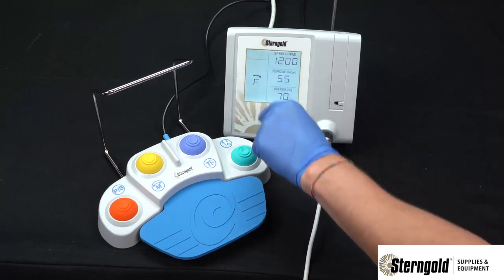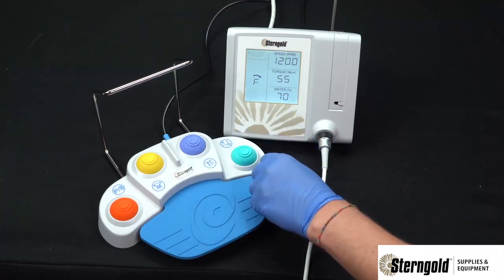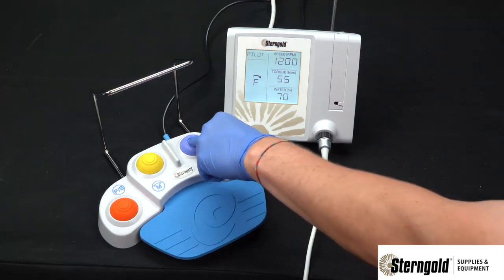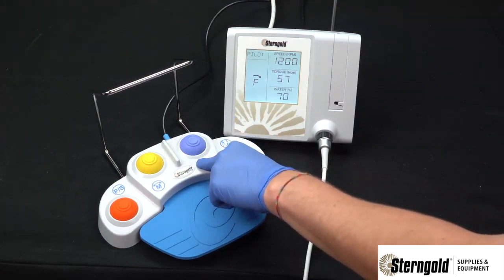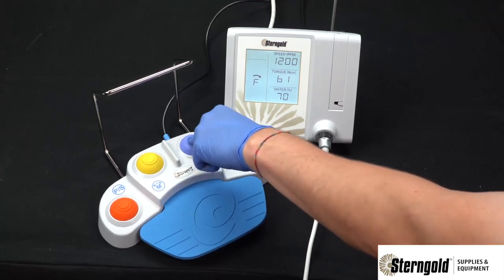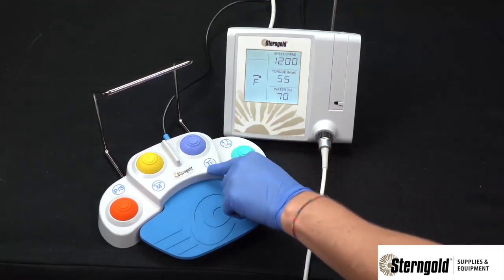Note that the preset is flashing at this point because we've gone off the original memory setting. The purple button is a torque adjustment — when pressed one time, the torque will increase by two newton centimeters. The user can go five steps of two, or ten newton centimeters total, before reverting back to the original torque setting.